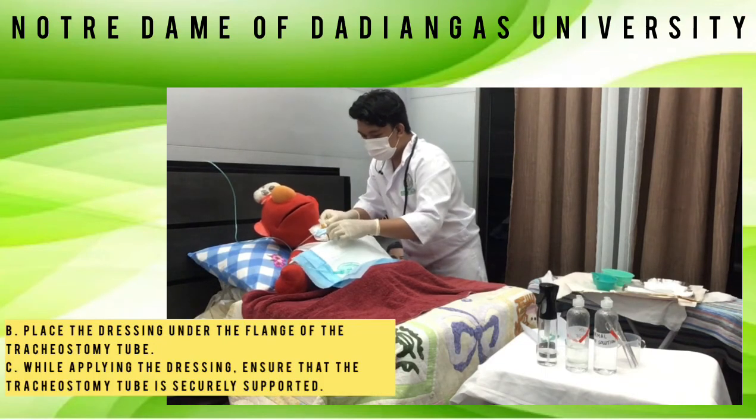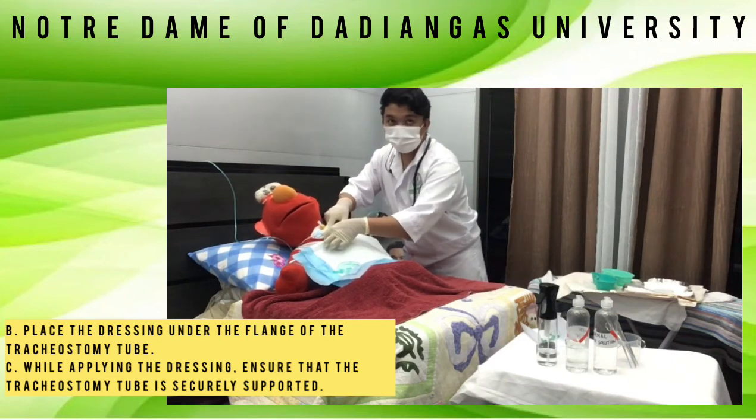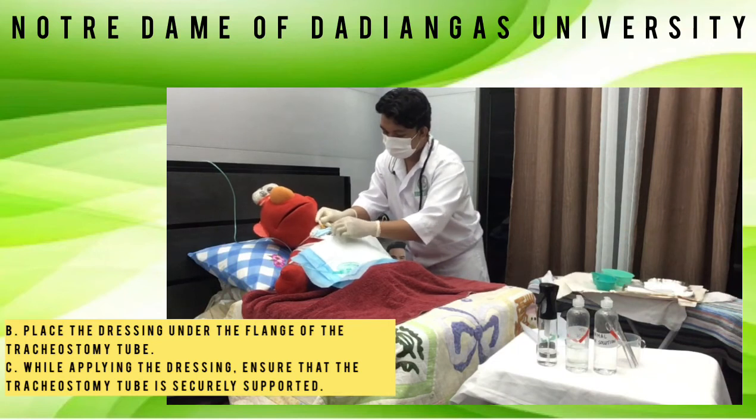Place the dressing under the flange of the tracheostomy tube. While applying the dressing, ensure that the tracheostomy tube is securely supported.